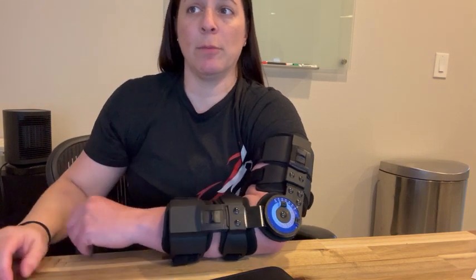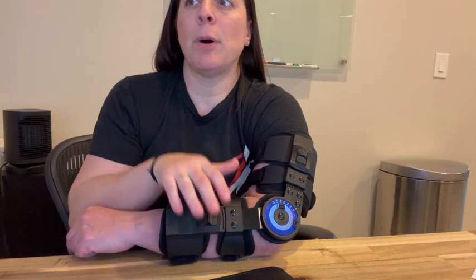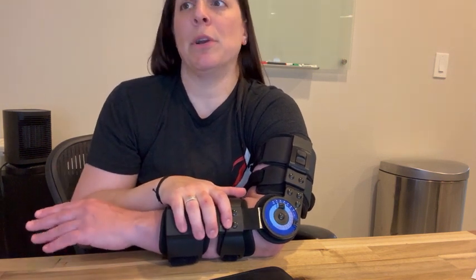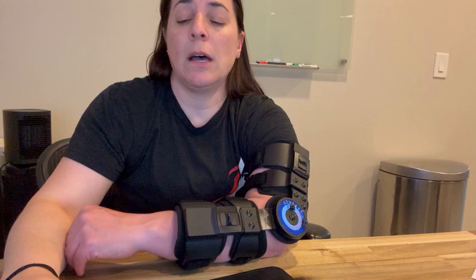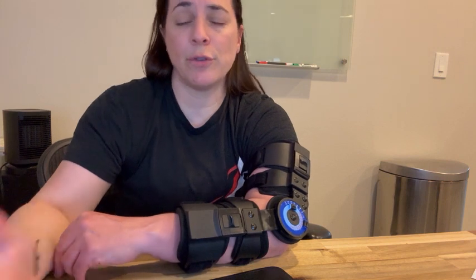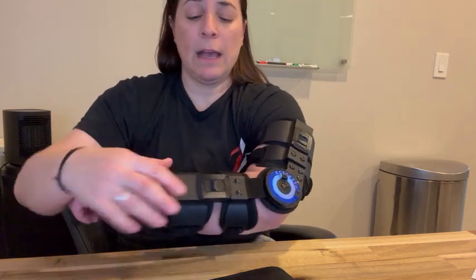Hey everyone, so I got this elbow brace — it's an adjustable post-op elbow brace and stabilizer splint for arm injuries. It can help with recovery support after surgery or fracture, or things of that nature.